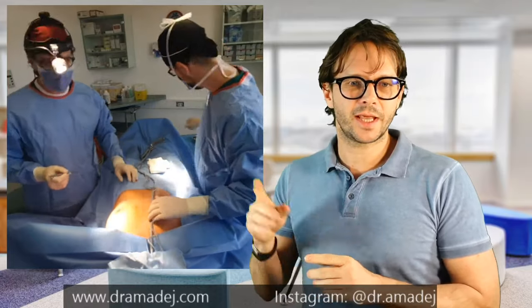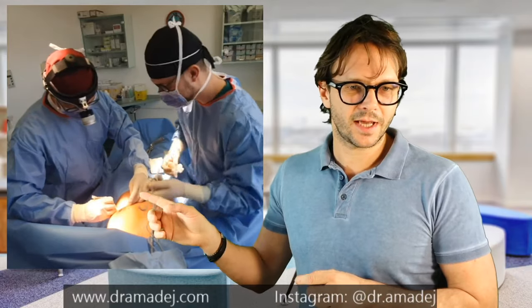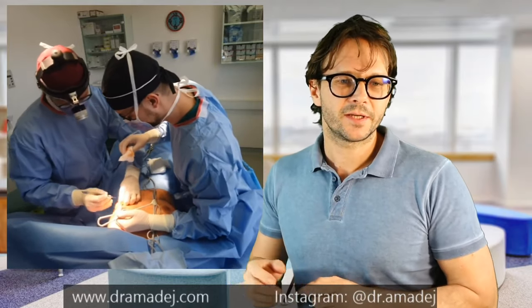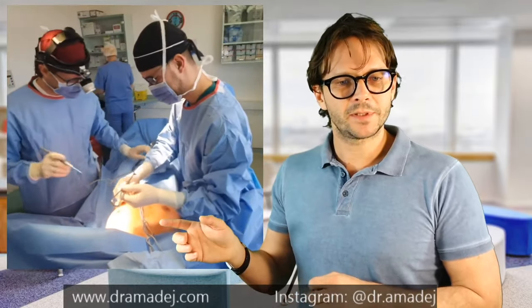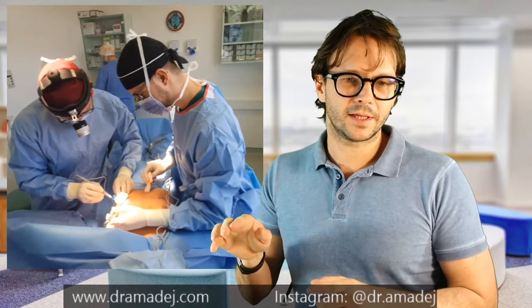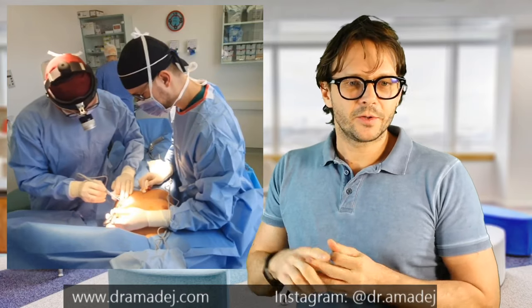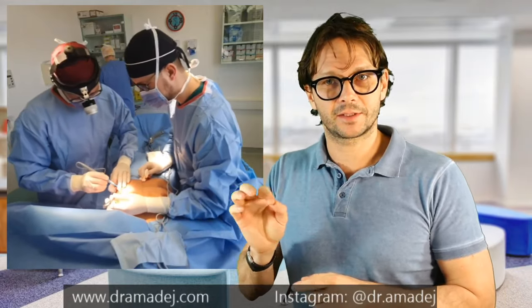A normal breast augmentation like this one takes about 25 minutes. After injecting everything thoroughly with local anesthetic, we are doing the first incision so we can enter the pocket where we will place the implants. In this particular case we are doing the incision in the inframammary fold, so the scar will remain hidden below the breast in the fold. We use cautery — this is like an electric knife — it helps cut through the tissues.